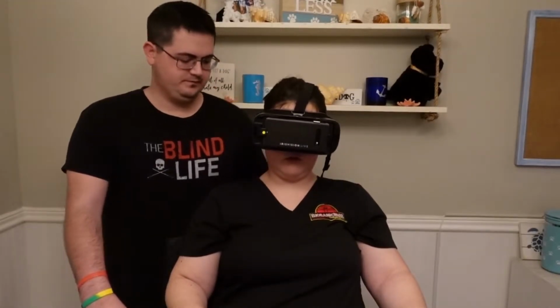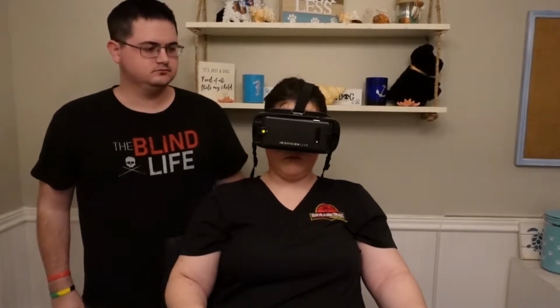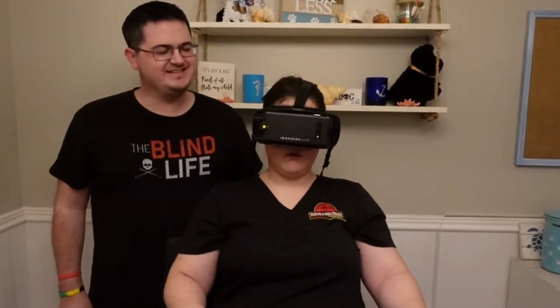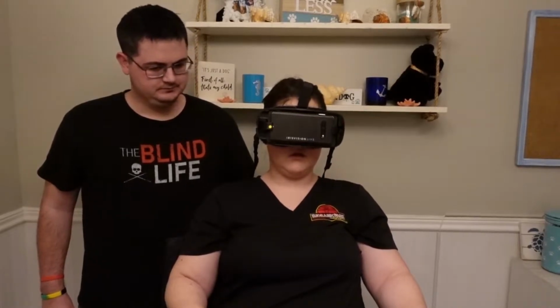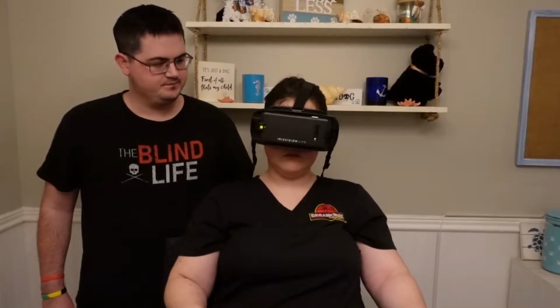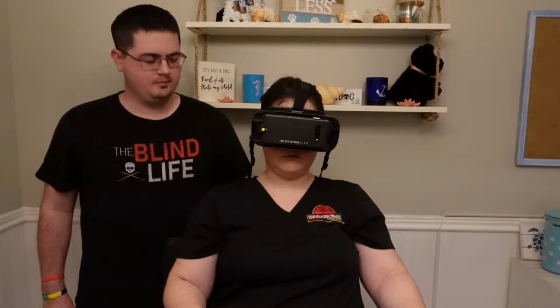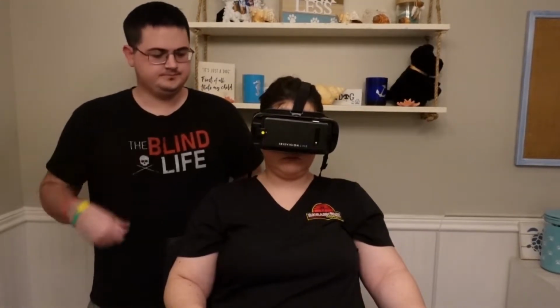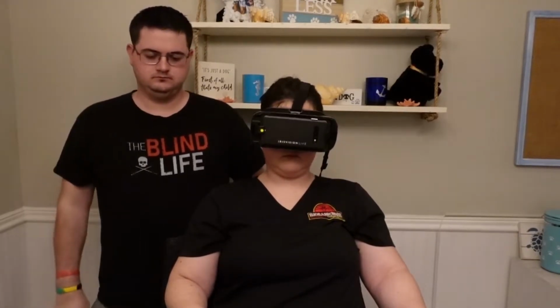Scene mode is the default live view mode. This mode replicates the vivid colors and contrast of the scenery in front of you. You're very vivid. To get here, you would either press that button until it says scene, or as we said, you would double tap and just say scene, which we demonstrated. Now, there are 9 other modes that are in with this.